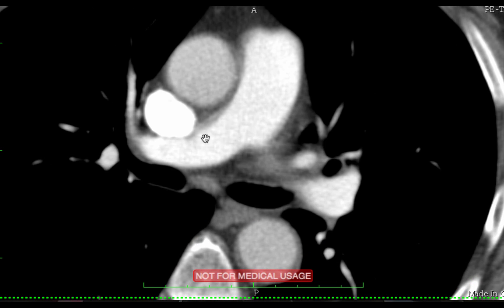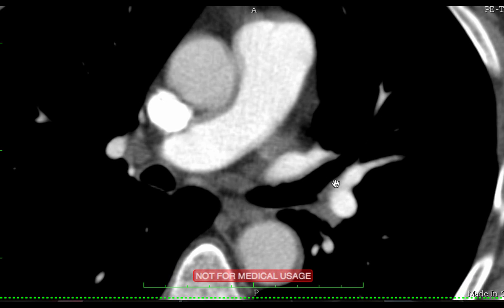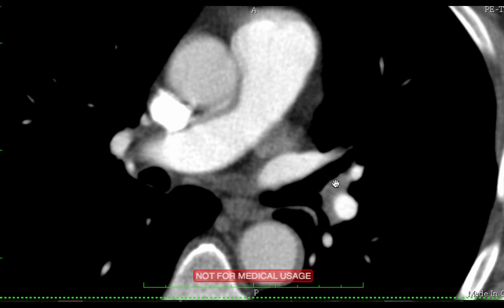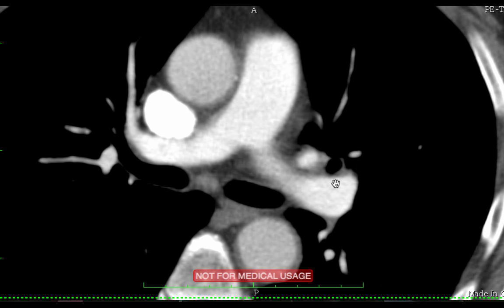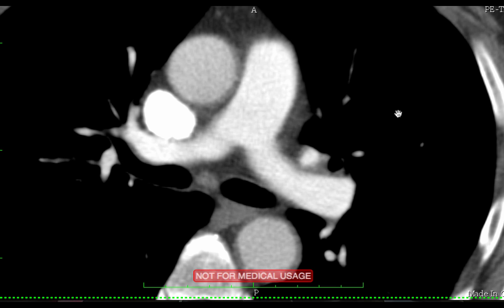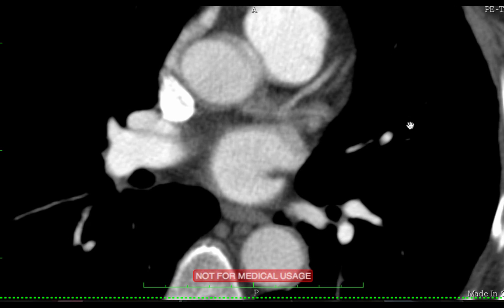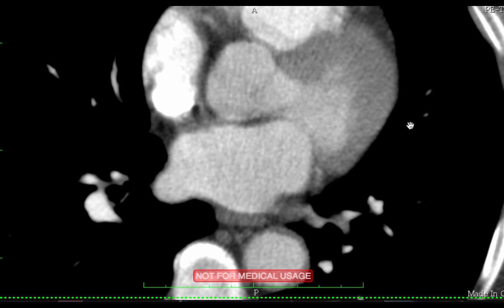Okay, so the pulmonary arteries go out and they branch through the lungs, and then they come back and they return through the pulmonary veins. Now, is this oxygenated or deoxygenated blood? In the pulmonary veins, it's going to be oxygenated. It just went out through the arteries to the alveoli of the lungs, and now it's oxygenated, and now it's going to come back into what chamber?